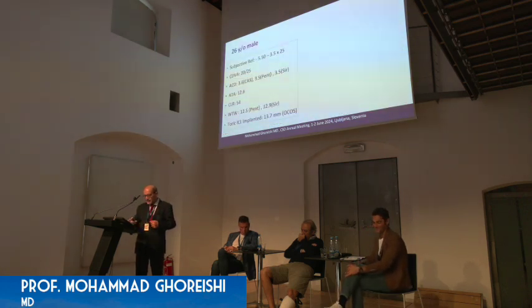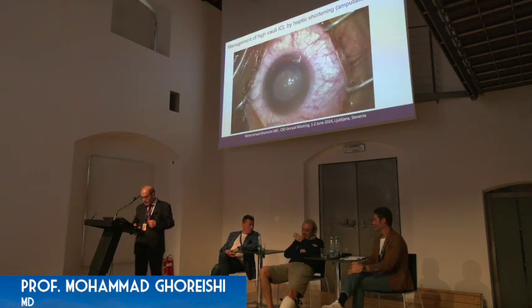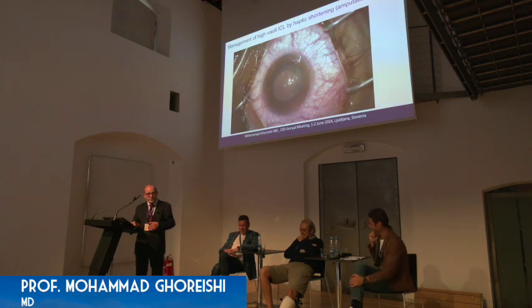This is a case with a very high vault. Based on OCOS, it was 13.7 millimeter, and the vault was very high and asymmetric. So my solution is a little bit different. I don't know if this will work.